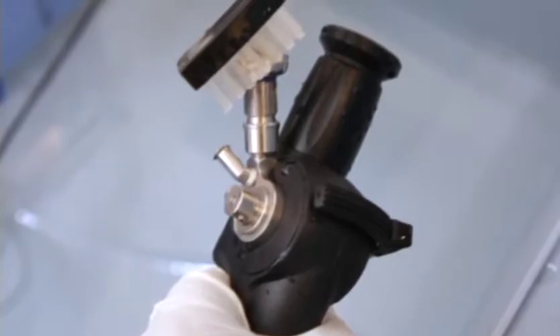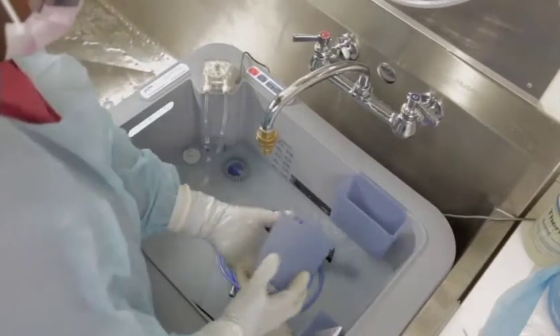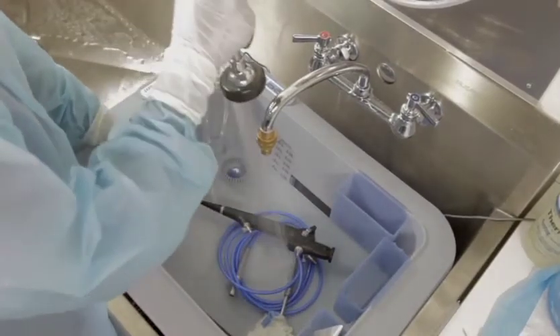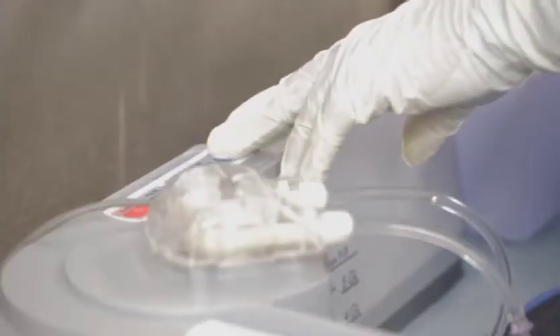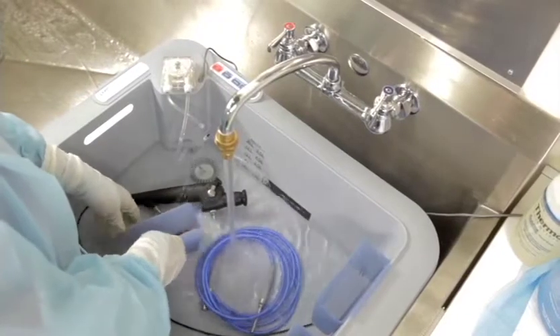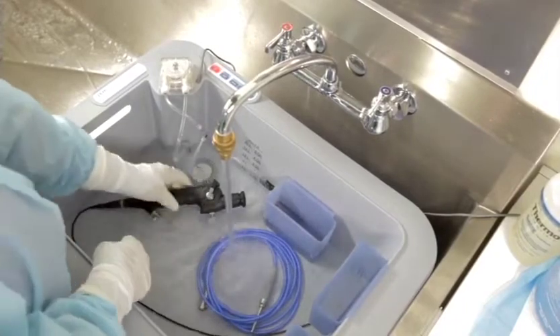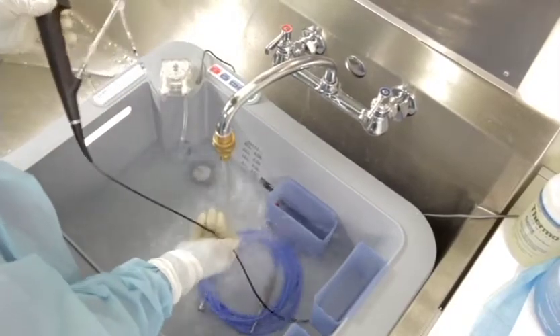Now you are ready to rinse the endoscope. Place it into a clean basin or sink and rinse with processed or sterile water. It is common for facilities to provide processed water to the sinks and machines in CSSD. Use a low-pressure device or an automated irrigation pump to flush the channels after cleaning. Rinse the outside of the scope with processed water. Do not use regular tap water, as it may contain waterborne pathogens that can lead to biofilm formation in the channels and on the scope exterior. You have now completed the manual cleaning of the flexible endoscope.